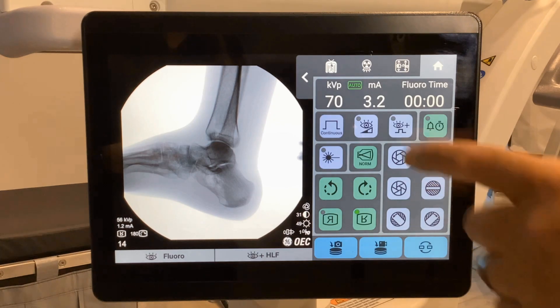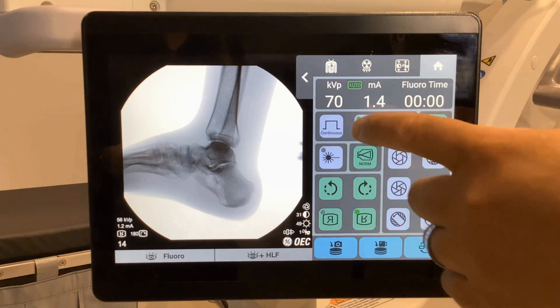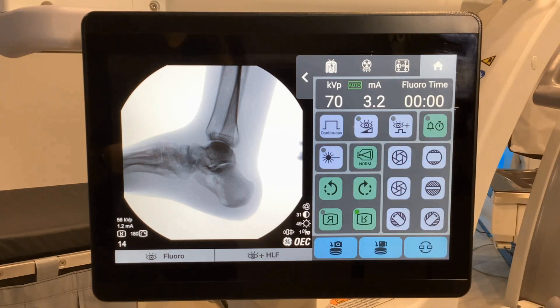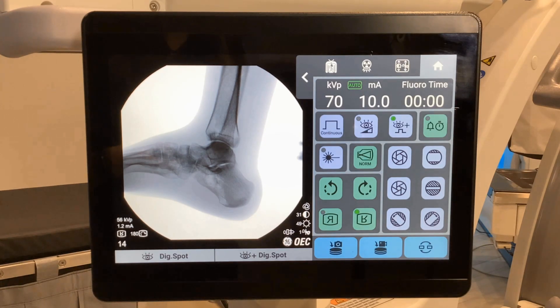Low dose. Notice the change in technique. Digital spot. Notice the icons change on the status bar.